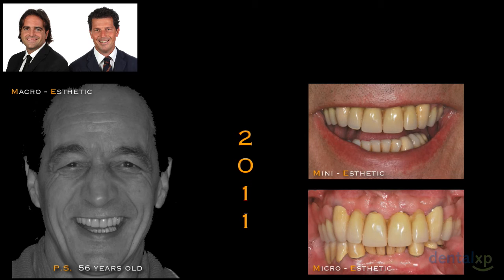As we always do for every patient that we visit for the first time, we start collecting information. Most of the information is achieved from the photographic setup, in which we can do the macroaesthetic evaluation with the facial analysis, the mini aesthetic evaluation with the dentofacial analysis, and the microaesthetic evaluation with the intraoral pictures.